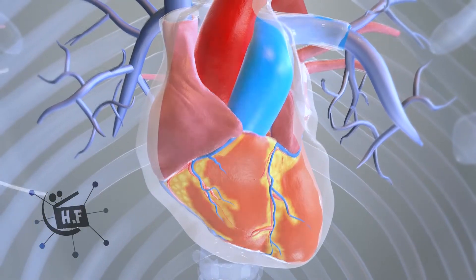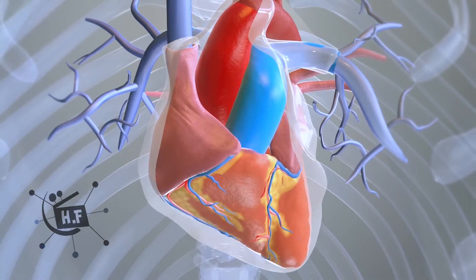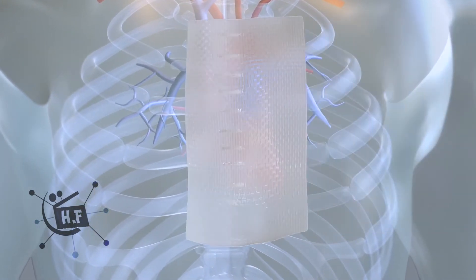The heart-lung machine is detached, and the patient's heart is made to function on its own again. The sternum is then closed with metal wires. Then the chest skin is stitched, and a bandage is applied.